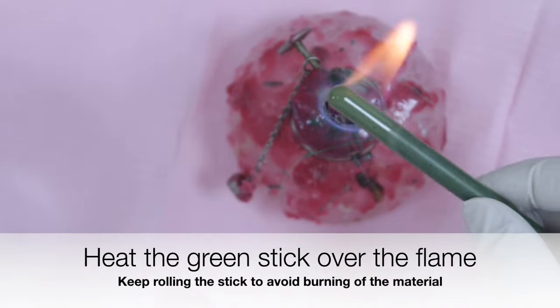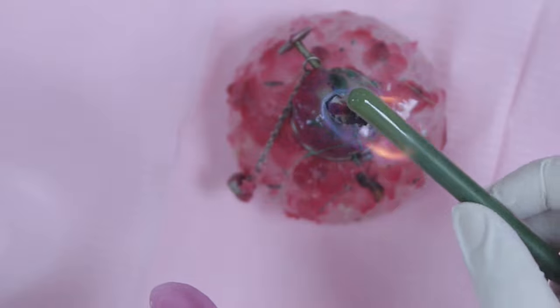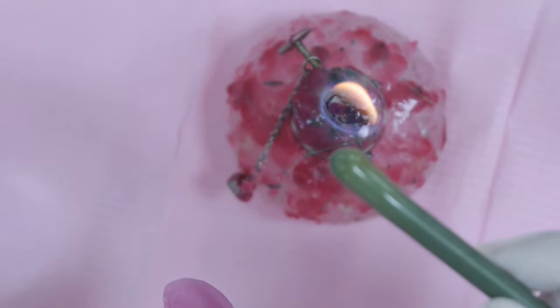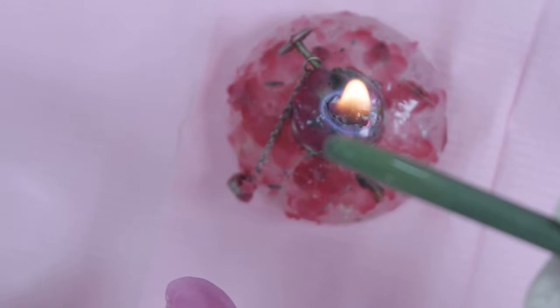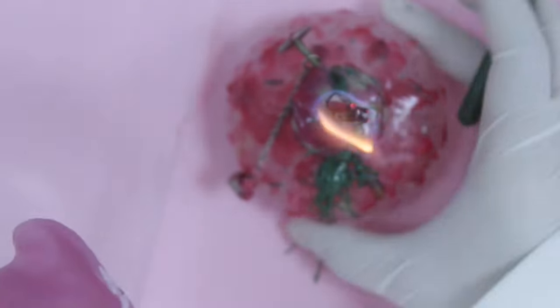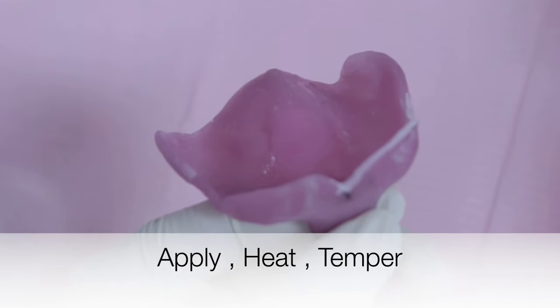Low fusing impression compound, or green stick, is the material of choice for border molding. The material is heated over a direct flame. Once you see that the material has become glossy and has dropped slightly, it's ready to be loaded on the tray. The material is applied incrementally to the tray borders.